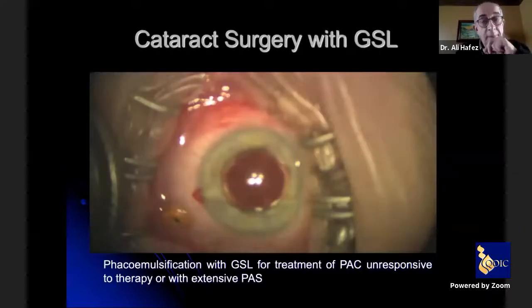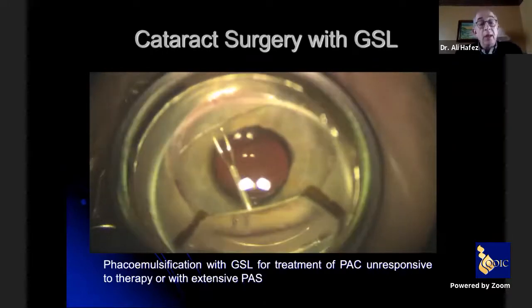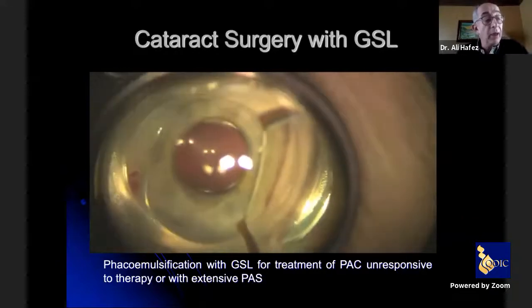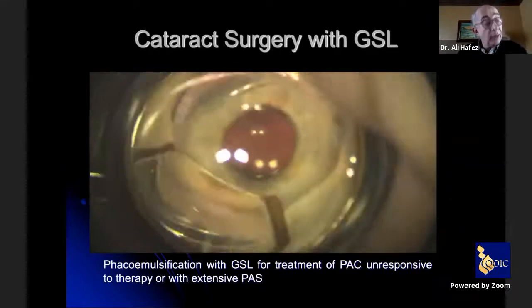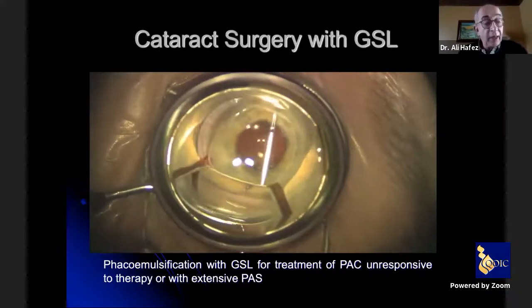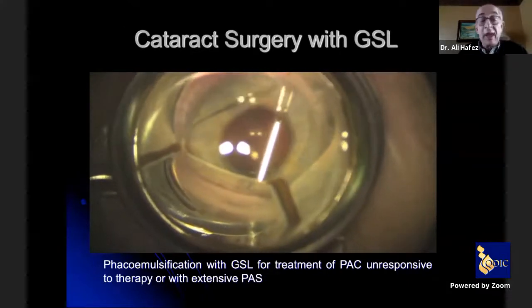Now, if you want to supplement that with goniosynechialysis, so if we're dealing with a case of primary angle closure unresponsive to treatment because of extensive peripheral anterior synechiae, again, direct viscoelastic injection into the angle of the anterior chamber. Then we can either use an iris repositor, or we can use a peeling forceps at 25 gauge to release the peripheral anterior synechiae from the angle using a direct gonio lens. The important thing about the technique is to exert a gentle downward vertical force on the peripheral anterior synechiae, so a downward force rather than a radial force. That would help separate the synechiae without inducing any iridodialysis.